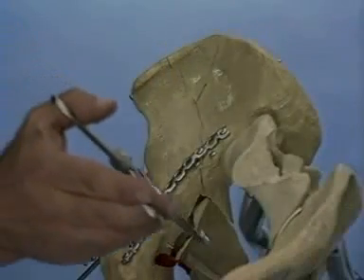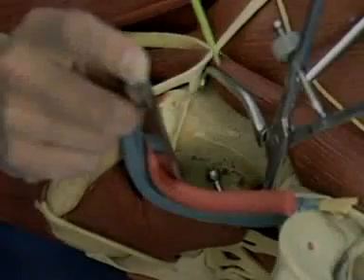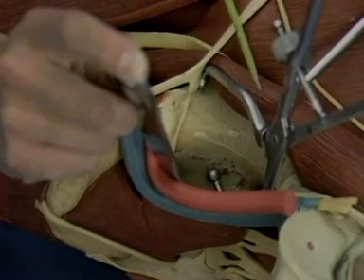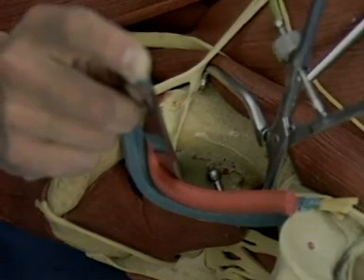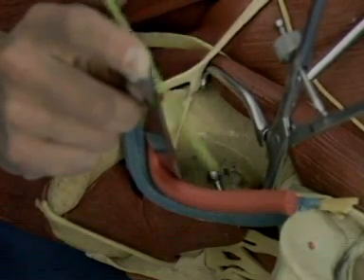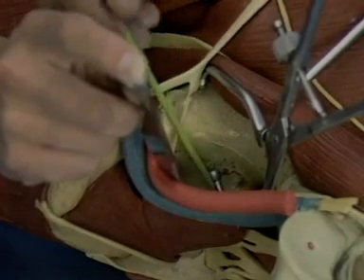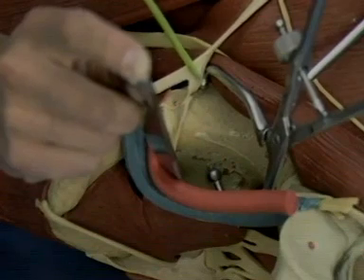The posterior column fracture site is now reduced with angled jaw ball-tipped reduction forceps. The small angle jaw clamp is placed in the second window of the ilioinguinal, just medial to the iliacopsoas and the femoral nerve, and just lateral to the femoral vessels. One tip is seen on the quadrilateral surface, the other tip near the pectineal eminence.